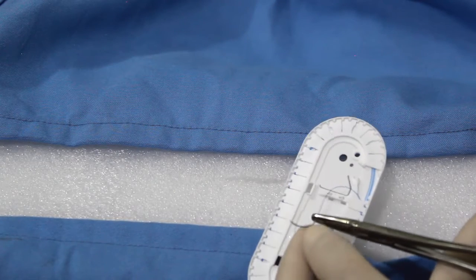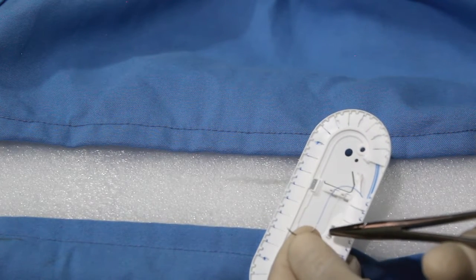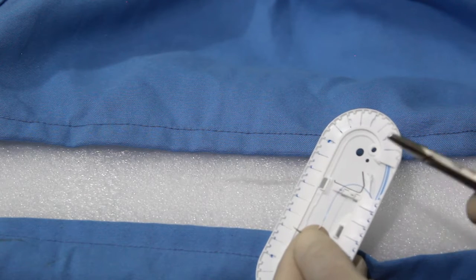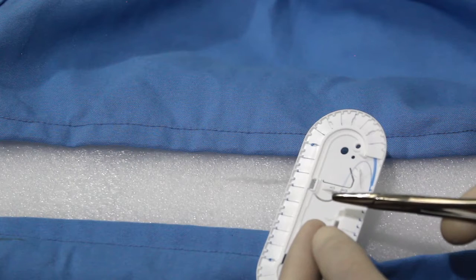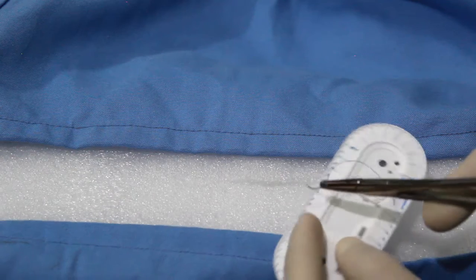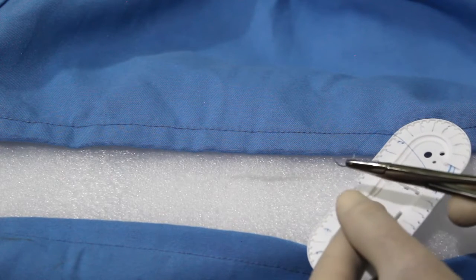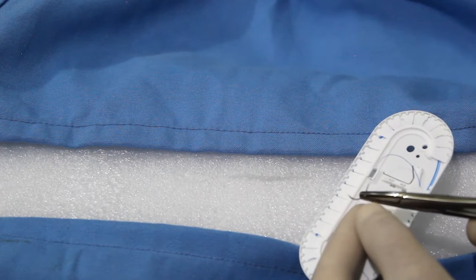For a needle, we have three parts: the tip or point, the body or the shaft, and the eye or the swaged end. For holding, the needle must be held in the needle holder at approximately three-fourths of the length of the needle from its point — or one-third from the eye. Do not hold the swaging zone to avoid damage to the suture or the needle.